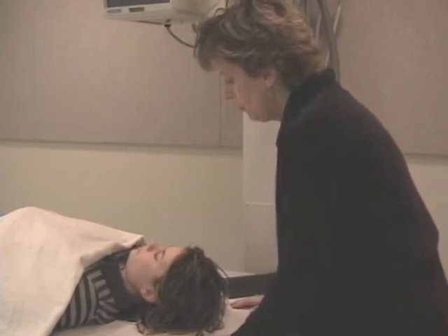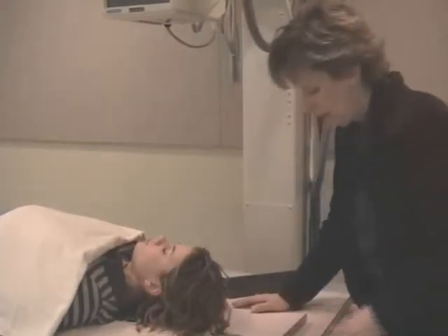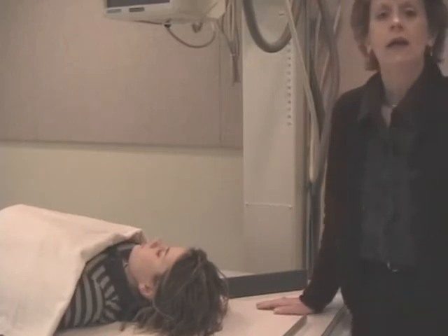Okay, we're going to let the patient relax for a minute and we'll do some talking. You notice that I had my patient in a recumbent position. A walkie-talkie type patient, you'll be doing these at the vertical board. The reciprocating buckies and the detail that you can get from the grids on upright units now is phenomenal, and most techs are doing these in a vertical position. You must be flexible enough to do these either in a recumbent or a vertical position, because a patient who's going to faint on you, you cannot sit them up. You have to lie them down.